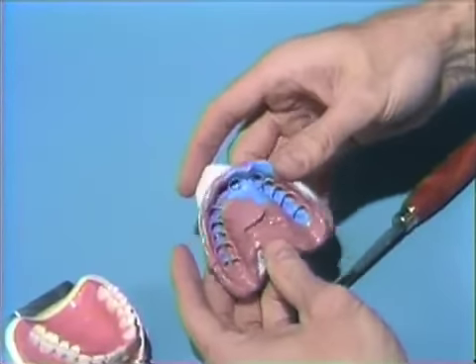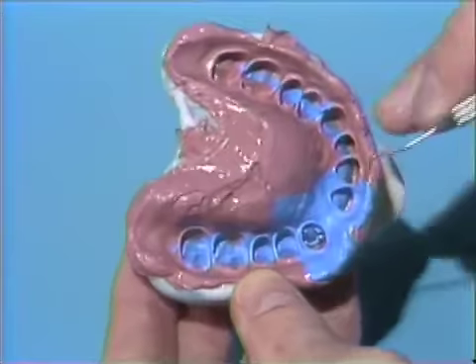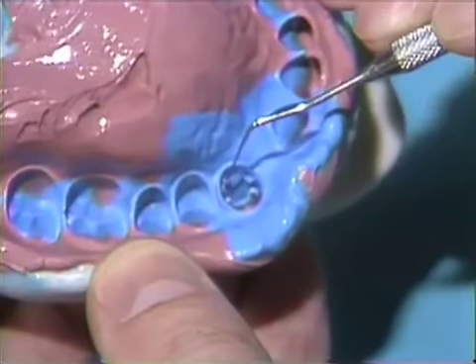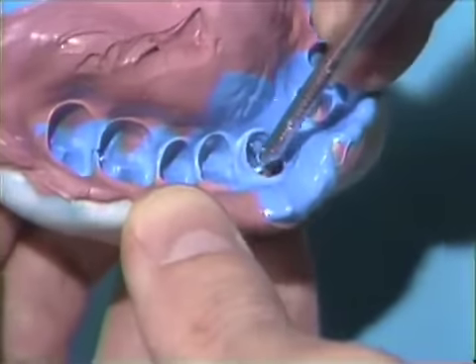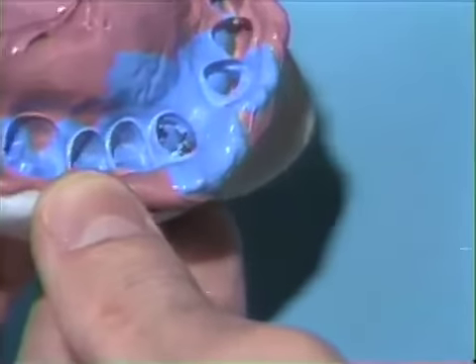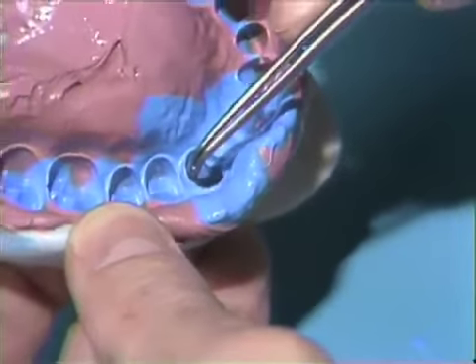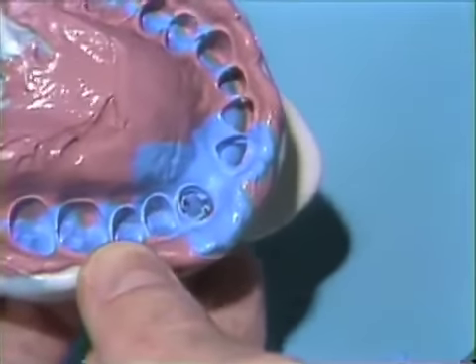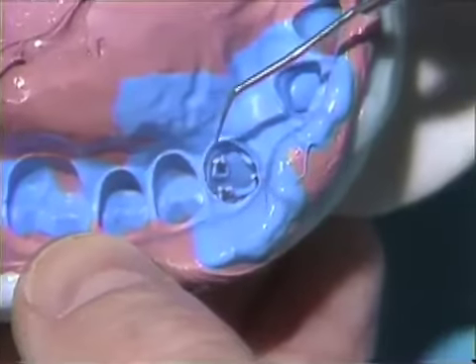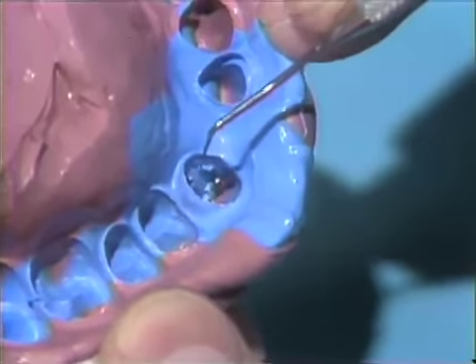Let's turn this over and take a look. You can see all our impression pins stayed in the impression — this doesn't always happen — but we have to make sure they're all the way in place. So we need to press down on each impression pin to make sure it's all the way down in its pinhole. If an impression pin does come out and stay in the tooth, we can just place it right back in and tap it to place. As you can see now, we can read the margins very easily down here along the cervical. Here's the cervical margin all the way around on the mesial, and the box is completely recorded.